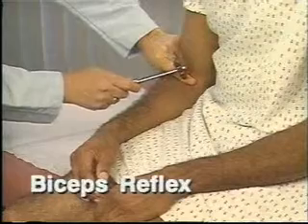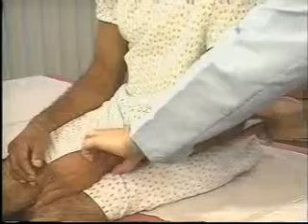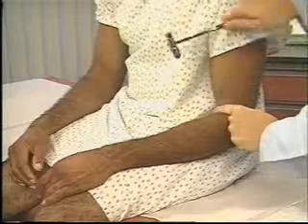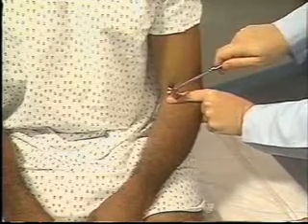Begin assessing deep tendon reflexes by testing the biceps reflex. To do this, the patient's arm must be relaxed, partially flexed at the elbow, and positioned with the palm down. To stretch the muscle, depress the biceps tendon with your thumb or index finger. Strike your thumb or finger briskly with the reflex hammer. You should feel the biceps muscle contract and see flexion of the forearm.